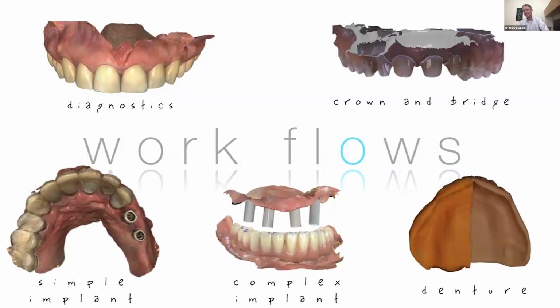And I found this very interesting because at Thrive Live, where I presented a couple of weeks ago, I was on the floor looking at one of the new scanners out there. A doc came up, looked at the scanner and said, oh man, can I do dentures with this? And the rep said, I don't know if we can do any denture stuff. And I looked at the rep and said, bro, you could do a lot of awesome denture stuff with your scanner. It's that old adage, you don't really know what you don't know. And you can do them with all these different things. So I decided to throw this in to show you briefly a couple of the different things that you can do.